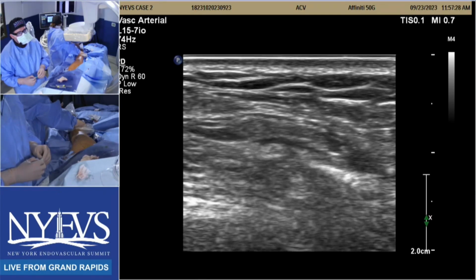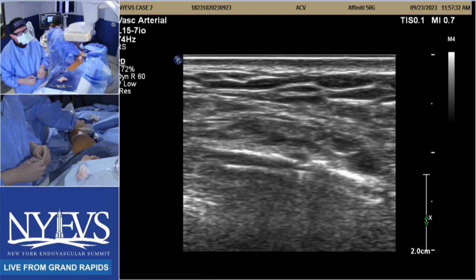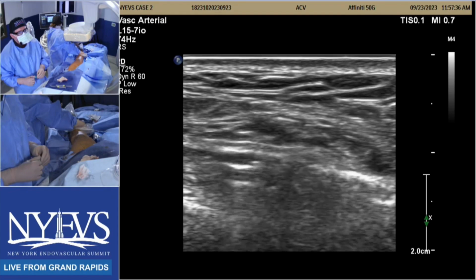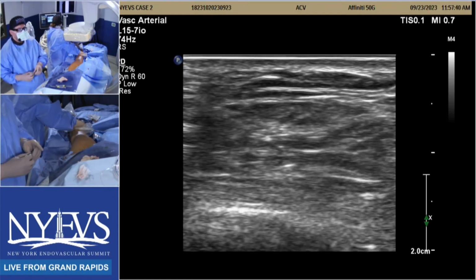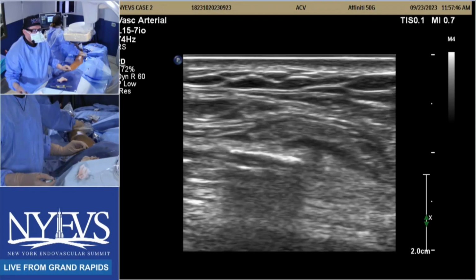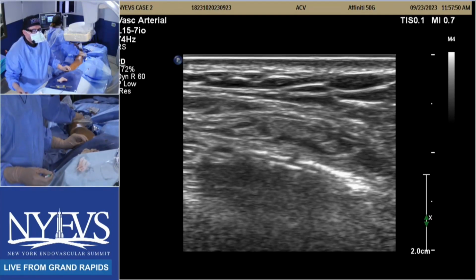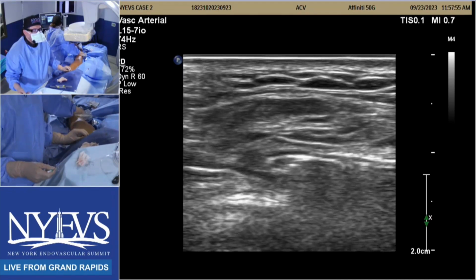Yep, agreed. So I'm going back and forth with the wire here. Here you go. So the wire engaged below that, what I call the lip. And Caitlin is going to show me the wire. I just crossed my CTO area. So what I'm going to do is I'm going to secure this. Very small victory. I'm a geek, so I'm calling this a victory. And my balloon is beyond the access point.